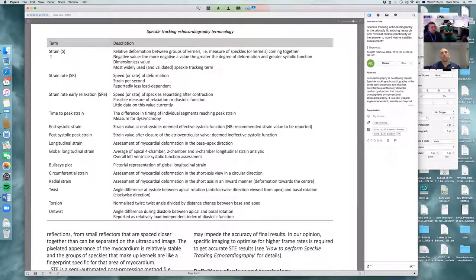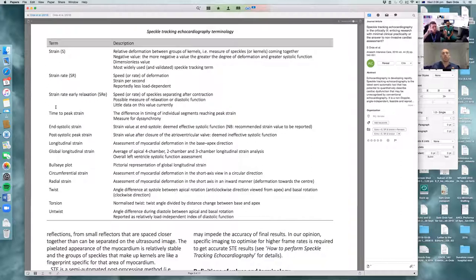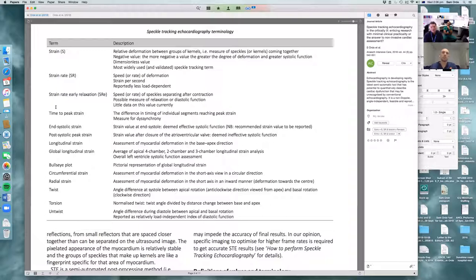Beyond strain, we can also get strain rate — the speed of deformation — as another way to assess systolic function. Similar to tissue Doppler's E' and A' at the annulus, we have strain rate early relaxation and strain rate atrial kick, which can serve as markers of diastolic dysfunction. We can also assess synchrony — if different parts of the myocardium are contracting at different times, we can measure time to peak strain: the interval between the earliest and latest segment contraction.